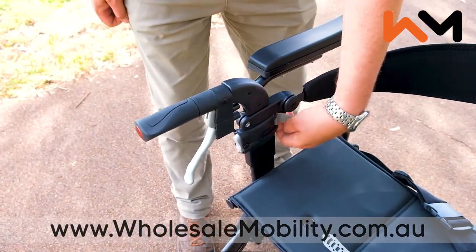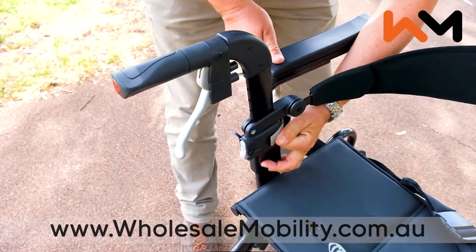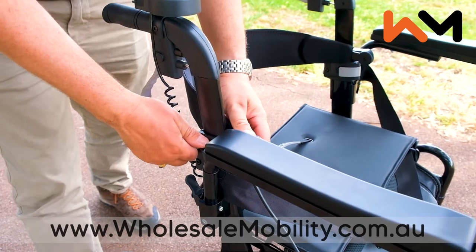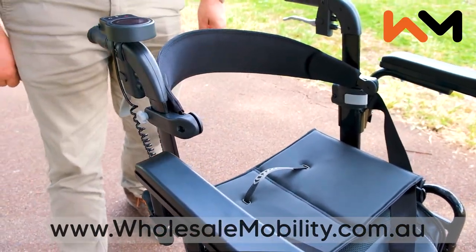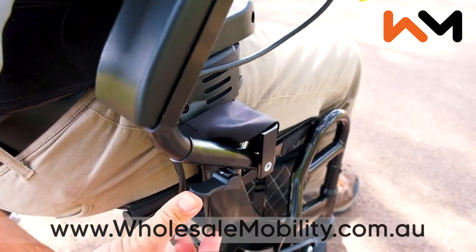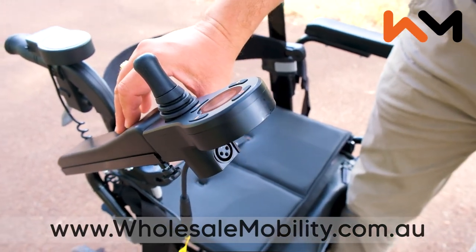Features include height adjustable handles, a height adjustable backrest, and flip up armrests with an easily accessible charging port.